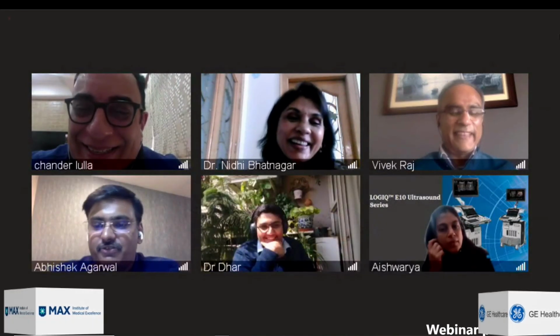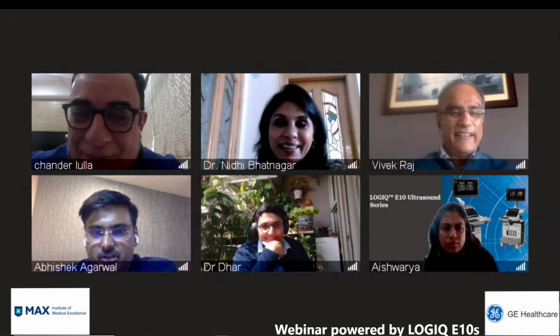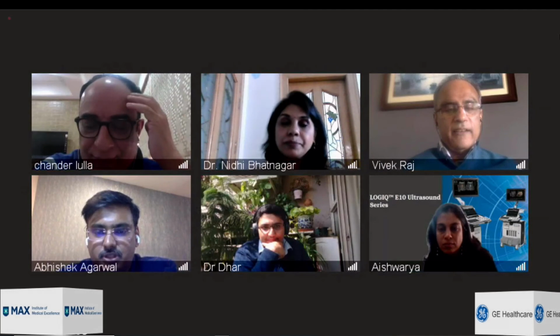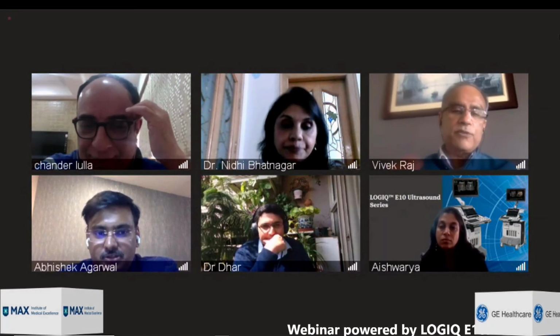Dr. Dhar and Dr. Vivek, do you get confused by the different values from different vendors? You must be getting reports from all sorts of places. Is there any standardization of reporting templates that you see, or do you see them as variable, and that's causing confusion in your day-to-day practice? We just look at the legend. Most of them give us a legend, which is important to give an estimate.